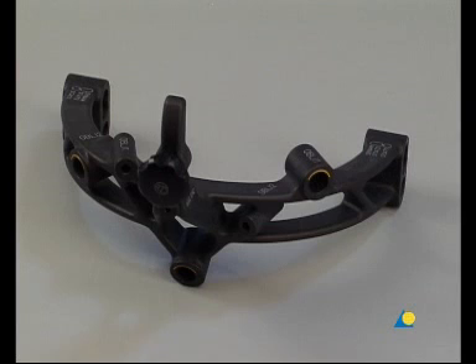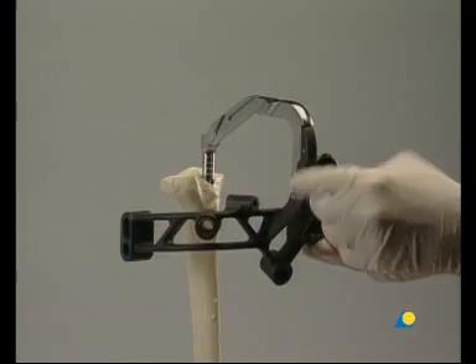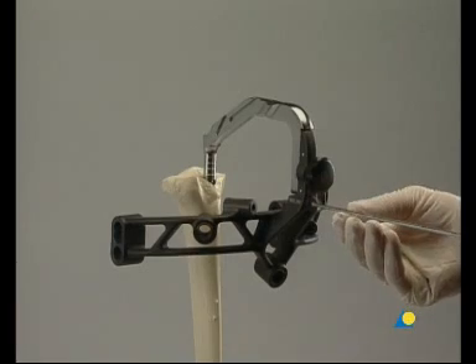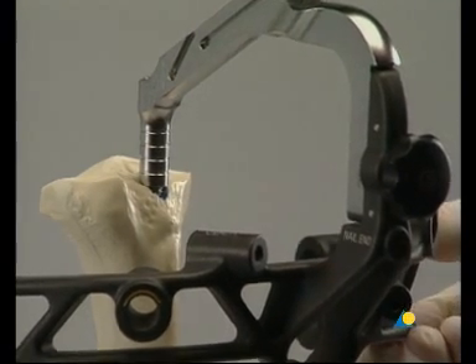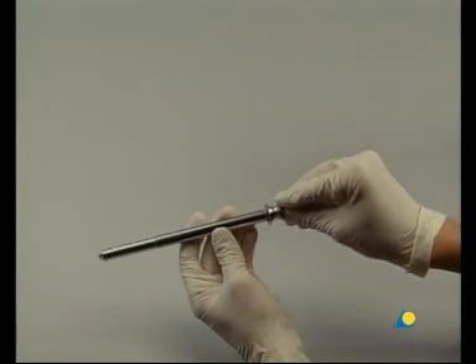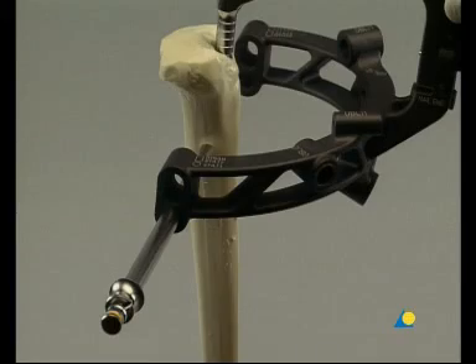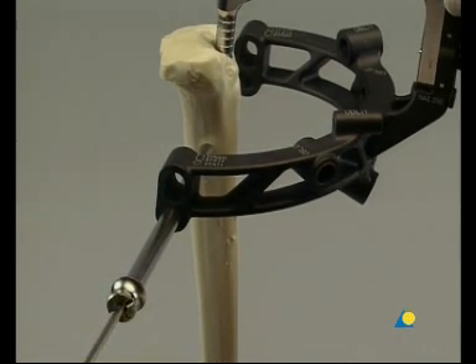As alternatives, dynamic proximal locking and oblique proximal locking will also be introduced. The aiming arm is attached and a 3.2 millimeter guide wire inserted. The tip of the guide wire indicates the exact proximal position of the nail in a medial lateral view. The three-part trocar combination, consisting of the corresponding protection sleeve, drill sleeve, and trocar, is inserted through the medial lateral hole in the aiming arm. The trocar is inserted down to the bone through a stab incision and is then removed.